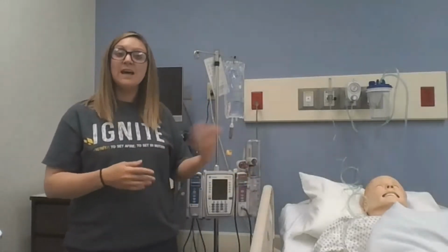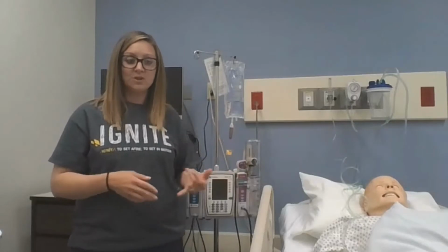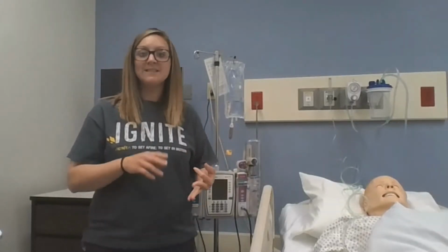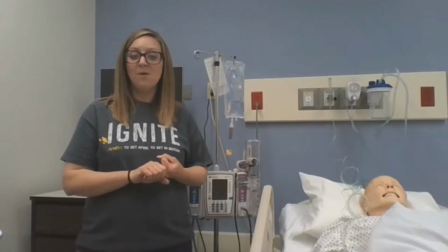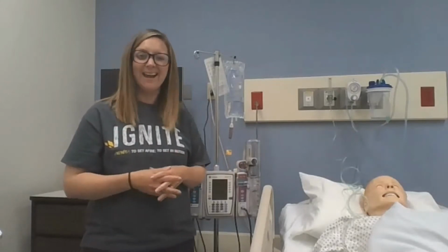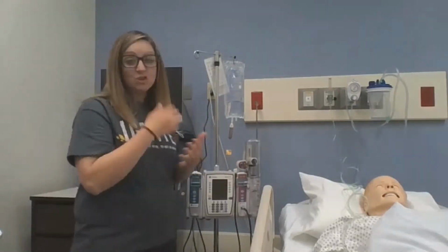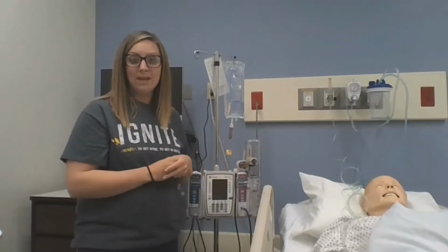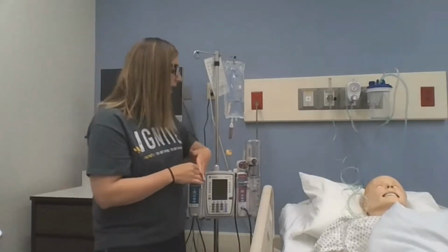mitigate some of the side effects of the narcotics, which is post-op ileus, again, fall risk, maybe some pneumonia. We want to make sure that we're doing good IS and nursing practice. They've got their DVT risk with the immobility and that kind of thing. You want to make sure that you have good frequent assessments, make sure that it's still appropriate for them to be on the PCA pump.